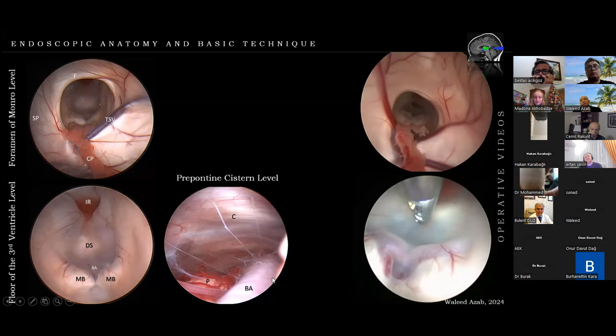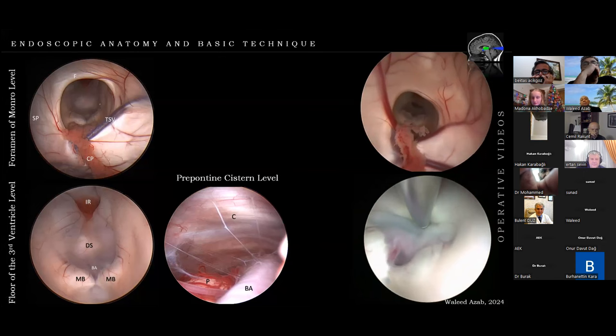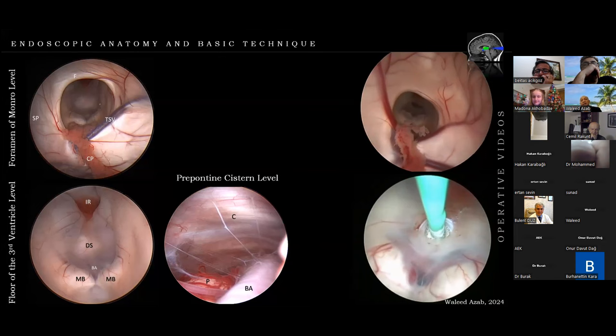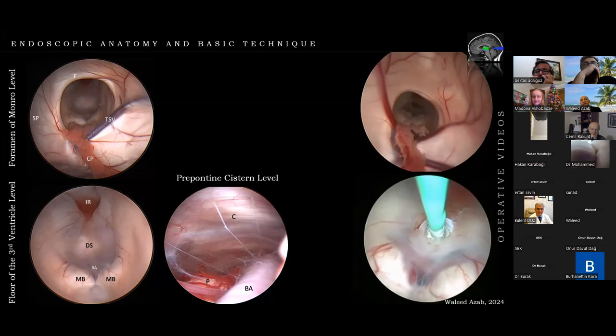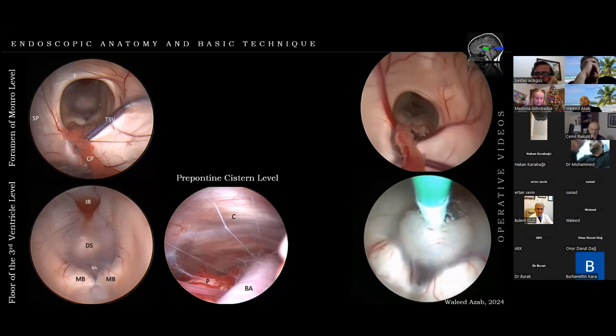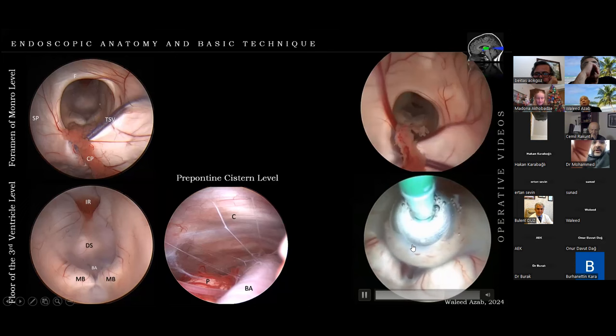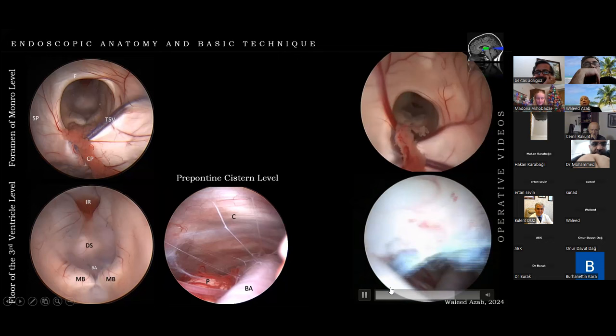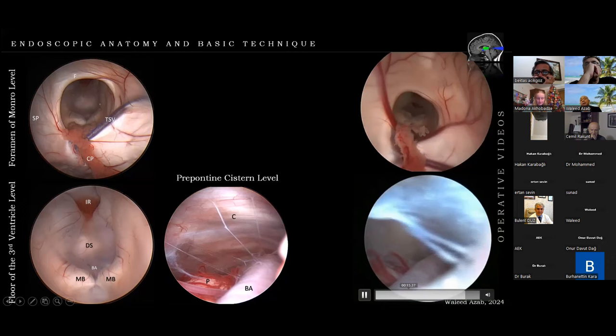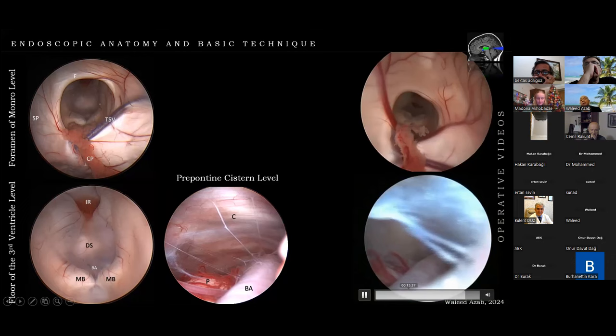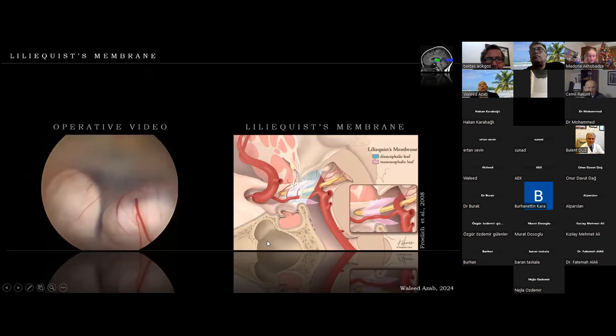Another example with a very transparent floor: you can see the two P1s and the basilar perforators. Note that the opening is not in the middle between the mammillary bodies as classically described — it is closer to the dorsum sellae, which is safer and more convenient. Inflation opens the membrane of Liliequist as well as the tuber cinereum, which is the floor of the third ventricle. The view into the prepontine cistern and the basilar artery is obtained, and the undulating floor indicates good flow.